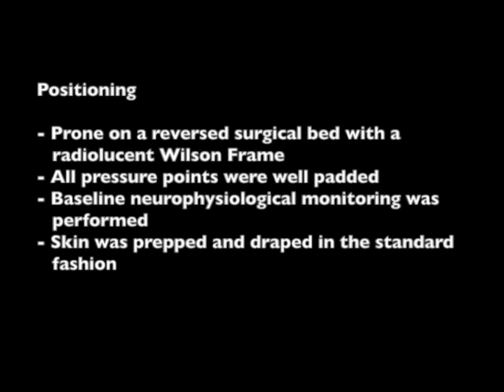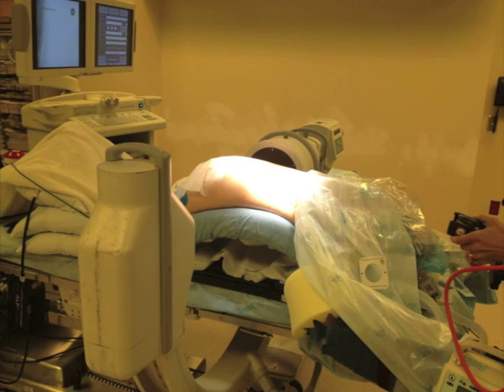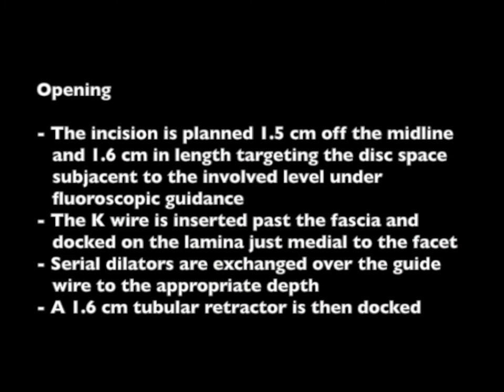The patient is positioned prone on a reverse surgical bed on a radiolucent Wilson frame. Pressure points are padded and the patient is draped in a standard fashion. The incision is planned 1.5 cm off the midline and 1.6 cm in length, targeting the disc space sub-adjacent to the involved level under fluoroscopic guidance.